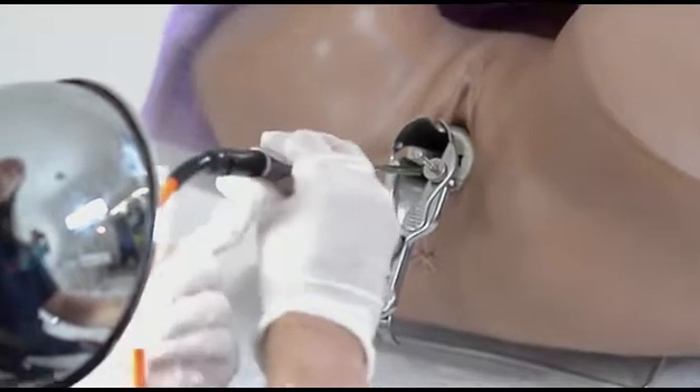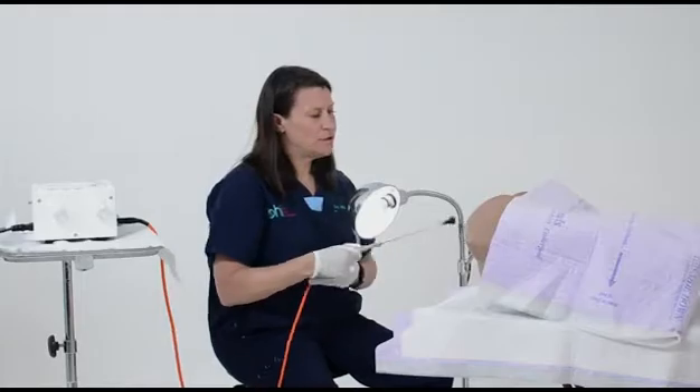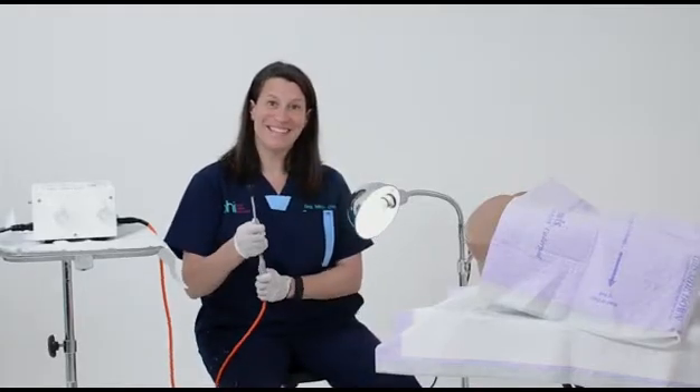Next, you take it out, and your patient is treated — and that's it.